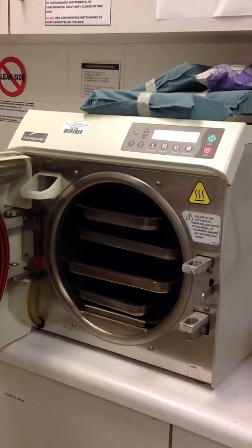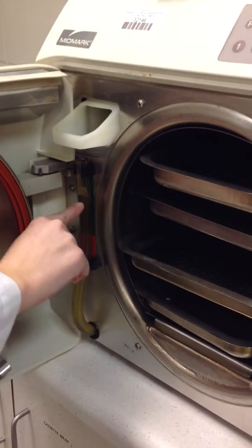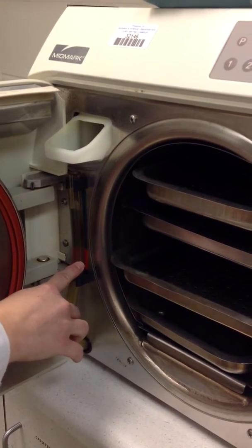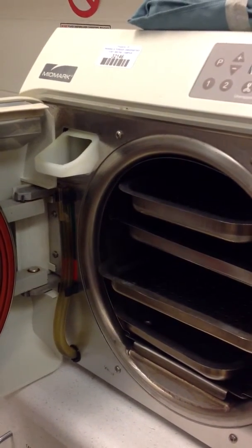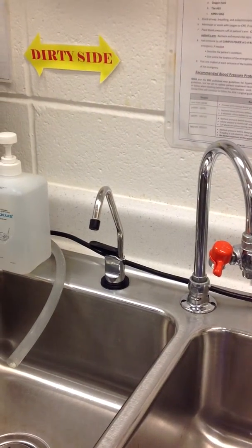The one thing we want to remember is that this is the water chamber. The water always needs to be in the green. If the water is in the red, we need to fill it using the autoclave water. The autoclave water can be found out of the distilled tap here on the sink.